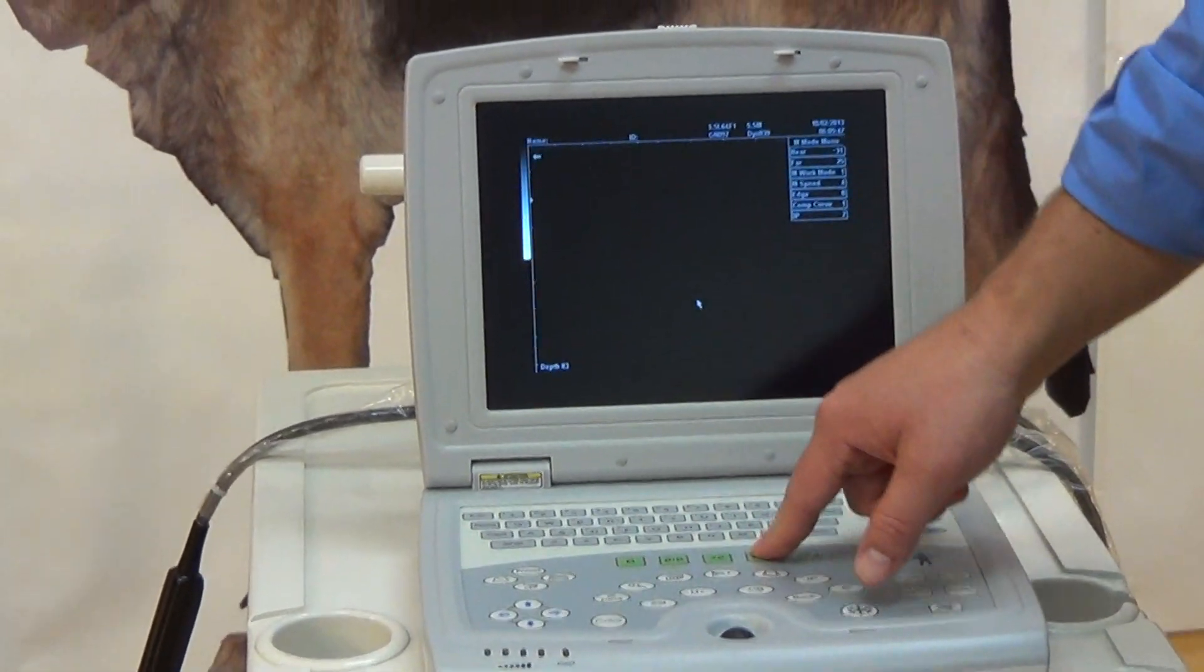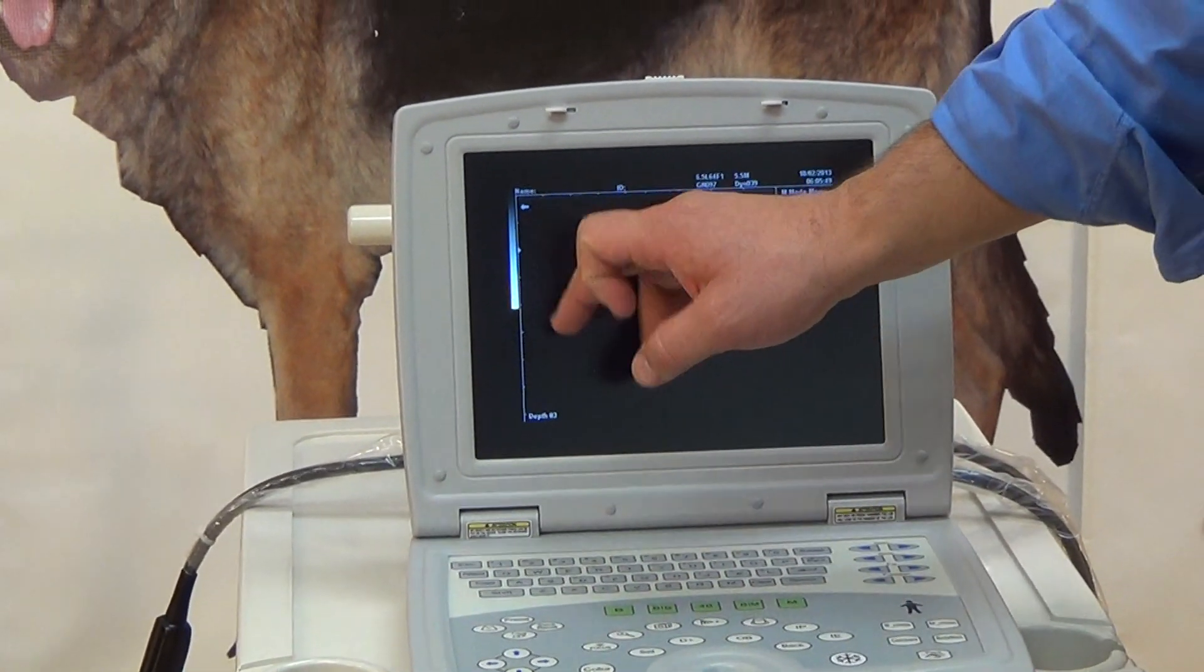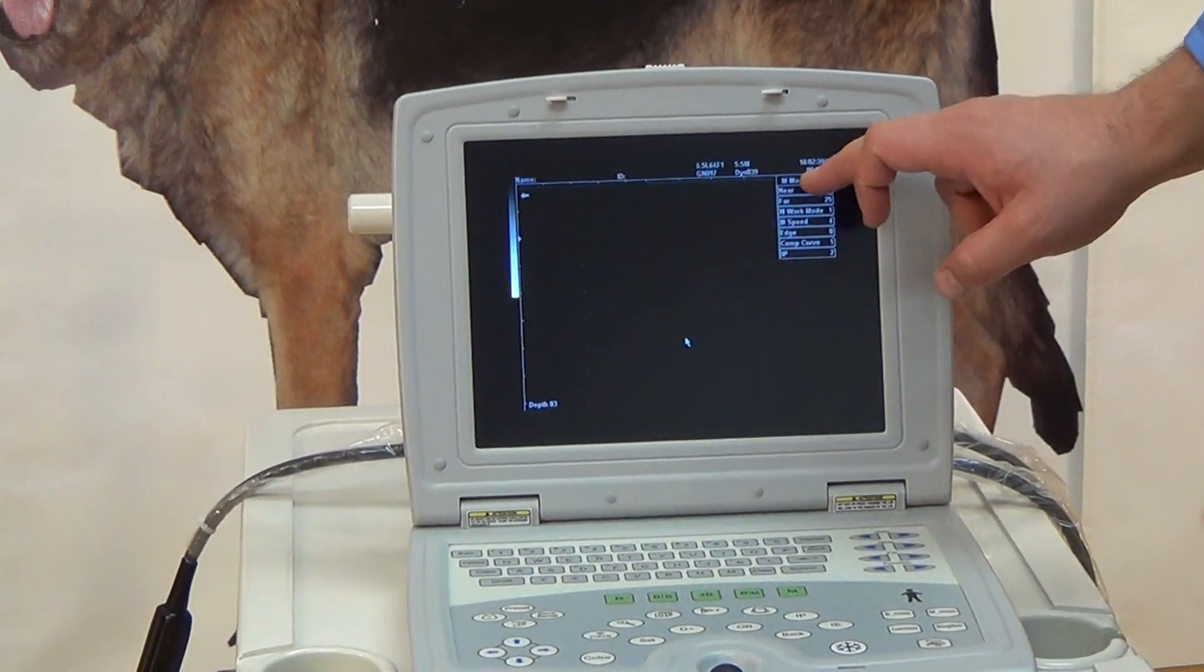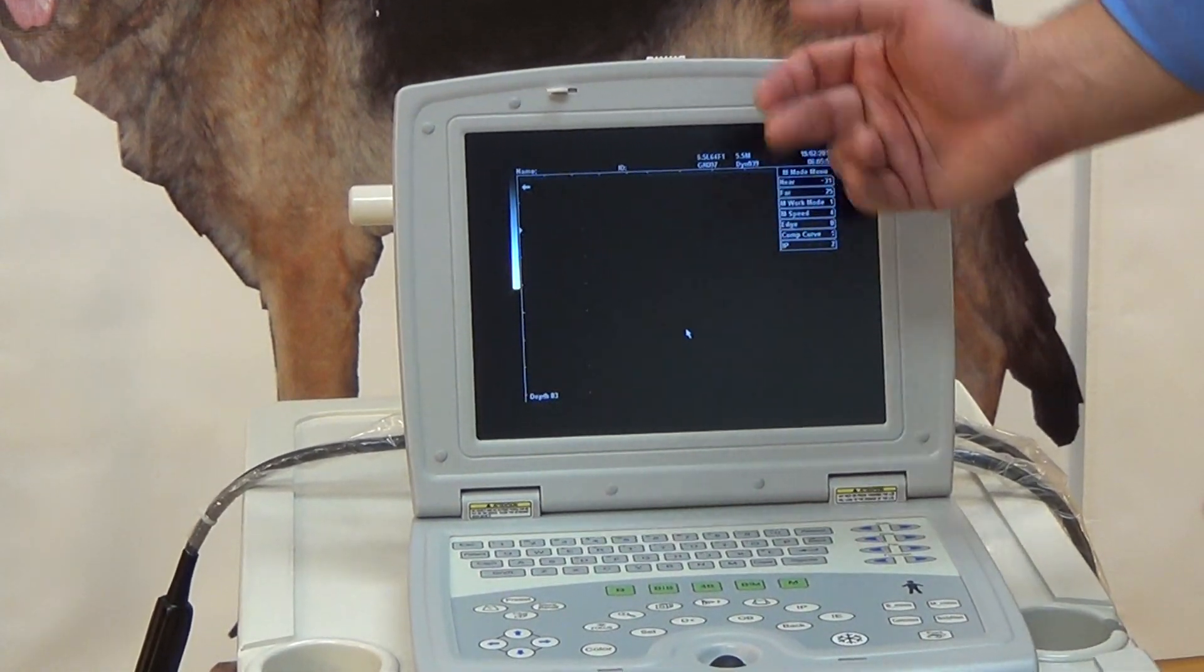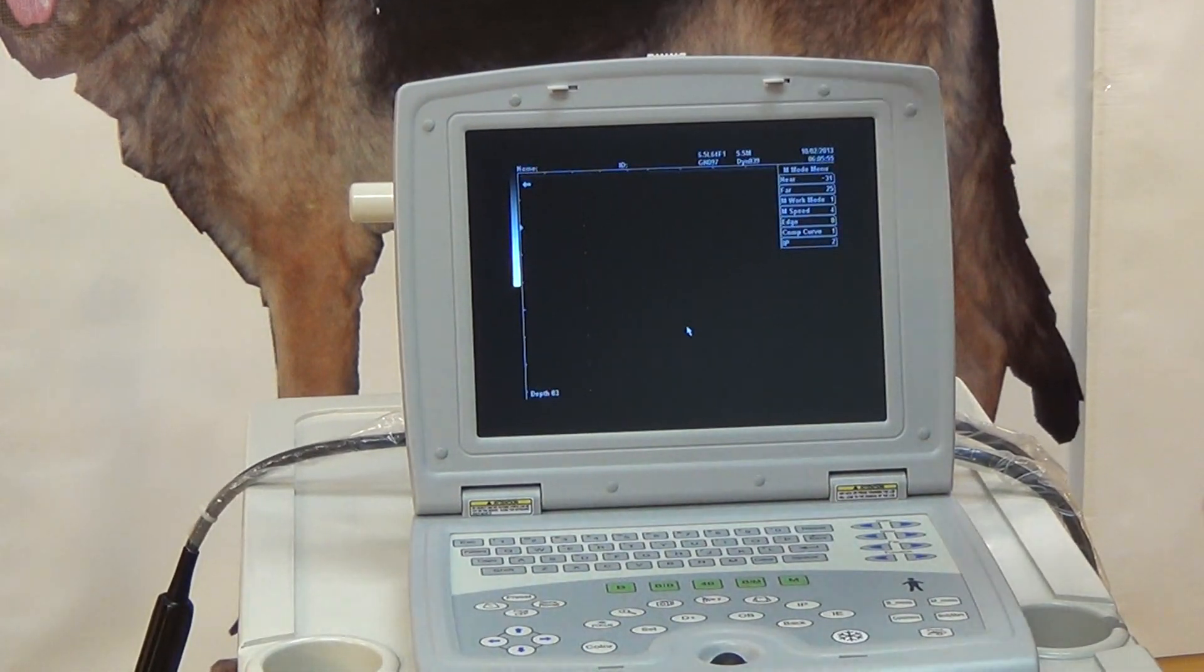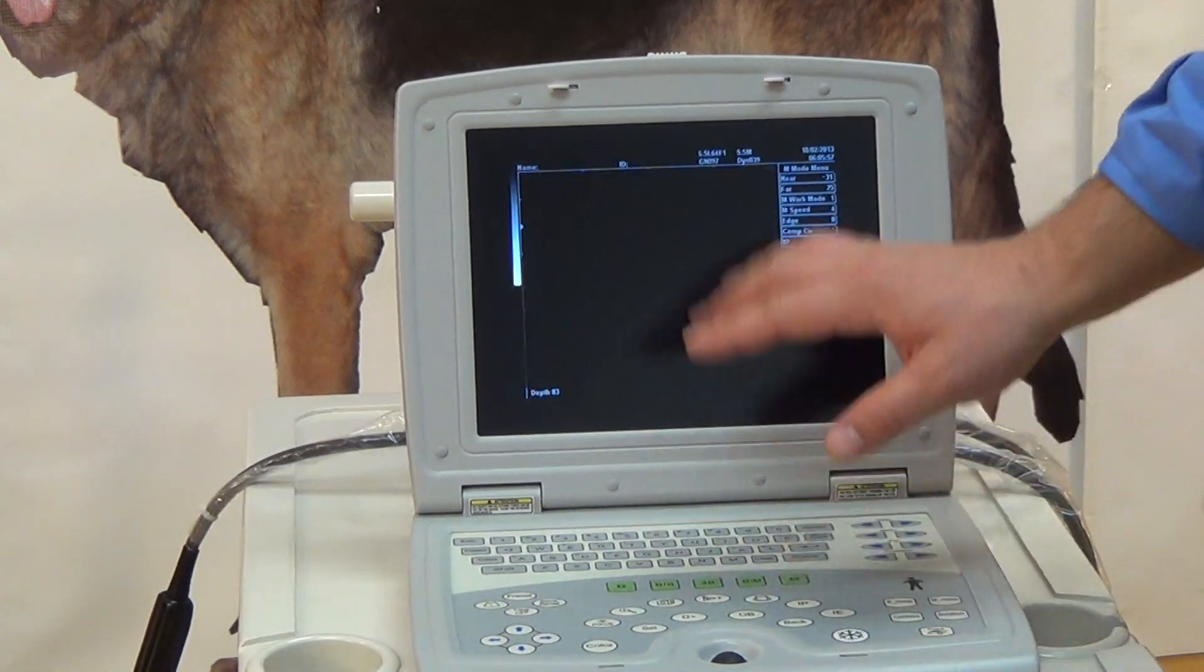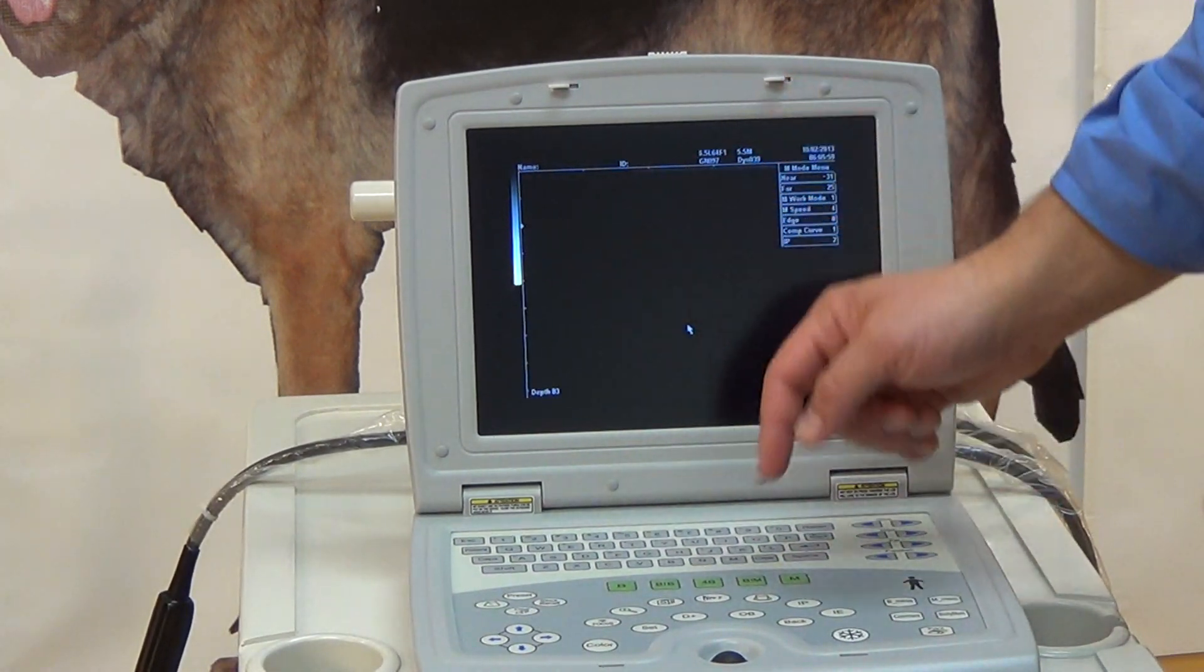Another setting is the B slash M mode. So this is good for measuring heart rate. You have your 2D image that you normally have, and on this side is the M mode. So you'll be measuring the heart rate while looking at it. Or if you don't want the dual, you can have just M mode for heart rate. Completely up to the user.